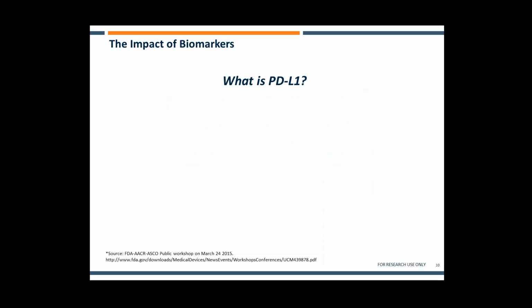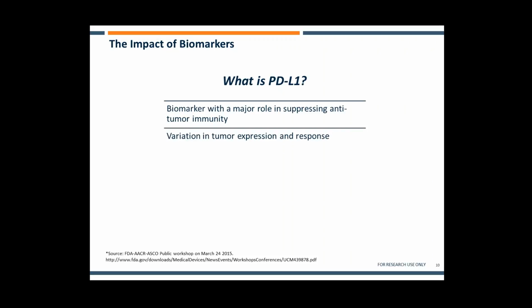So to put this into context, at the FDA AACR ASCO public workshop in March earlier this year, there was a large discussion that took place with regard to the particular biomarker PD-L1. So what is PD-L1? It's a biomarker with a major role in suppressing anti-tumor immunity.